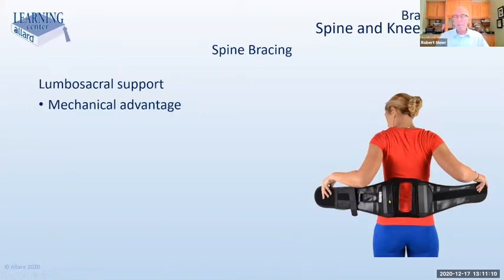And so we'll talk about the sequence of doing those and how tight to make them in just a minute. But this is a very effective brace for the lower trunk area, for the lumbar area, because it takes very little effort on those strings to create a lot of compression support. So very, very effective in doing what they're supposed to do.